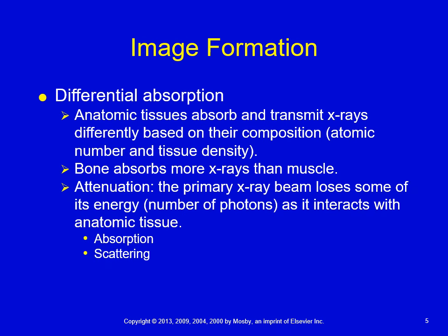Visually, I want you to think about looking at a chest X-ray, or you can pull one up so you don't have to visualize it in your mind. In the center you'll notice the spine, even though that's not what we're looking for in imaging a chest. You also have the rib cage, and within the image you see a lot of very dark or black areas.